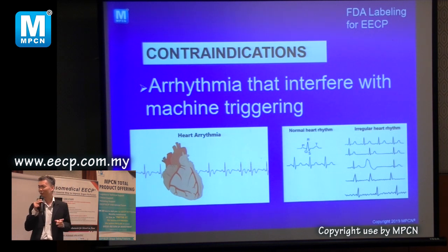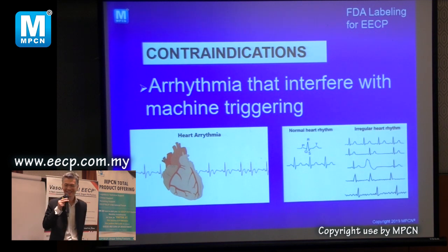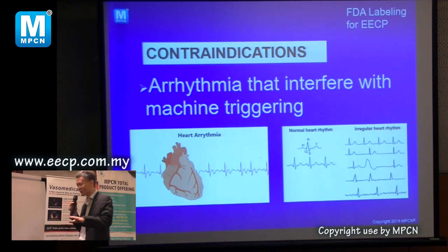But I have this patient that is very special. His body has a lot of this static. Have you heard of it? Have you had it before? This guy is very special. We do everything, but it's still the same, because he's like Iron Man, he has a lot of static. When you hold his hand, we reduce the static, then the machine can work.